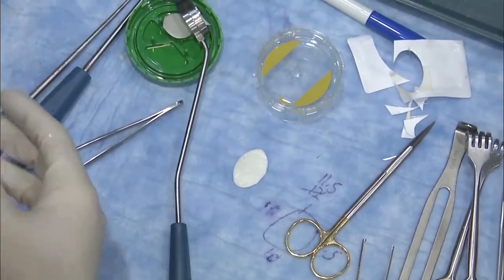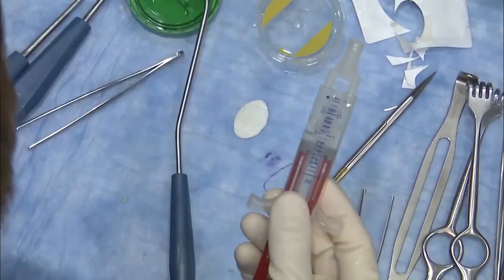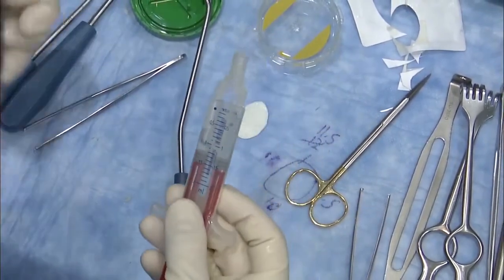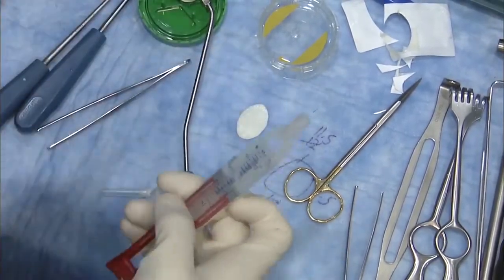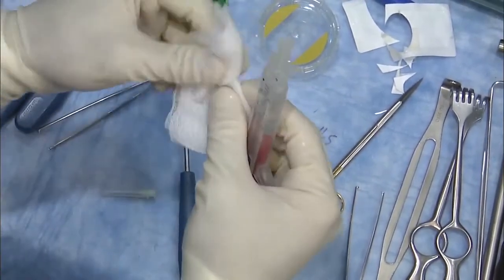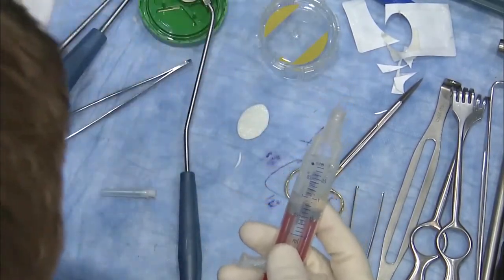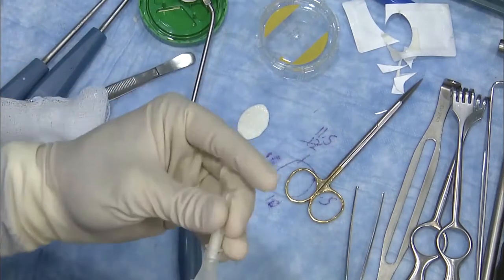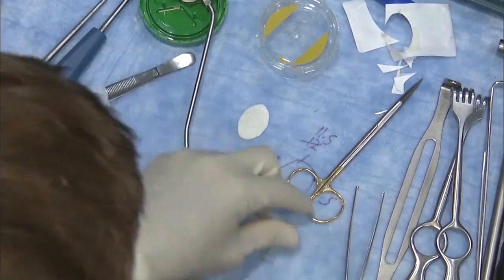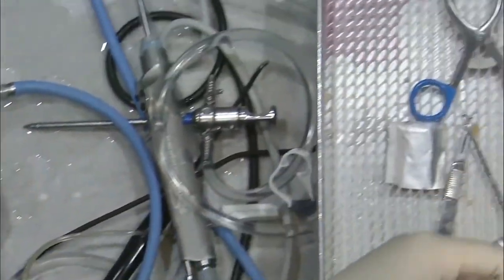So then this is our fibrin glue. This will come frozen, so you have to make sure that your nurses are helping you out by making sure that it's thawed and ready to go, because sometimes you're so quick now that you'll beat them. This isn't even thawed before it's ready. So we'll put the tip on, and then we'll just come back to the knee here and get set.